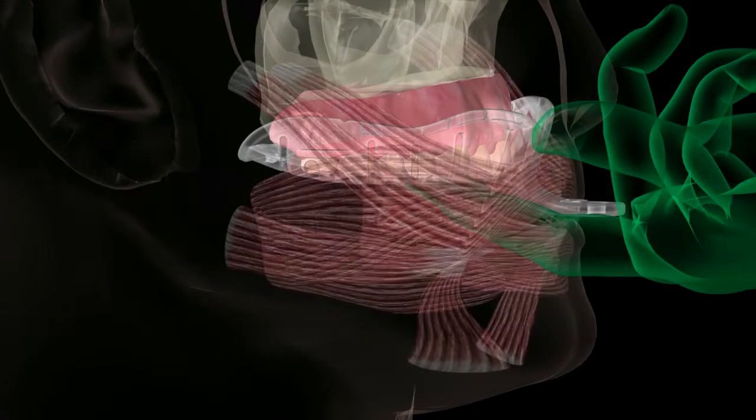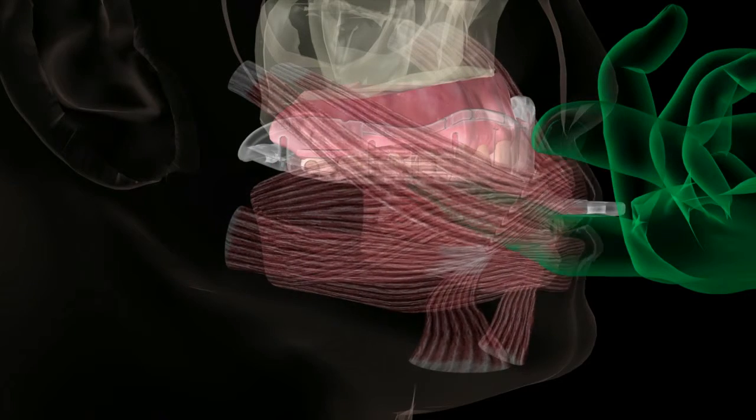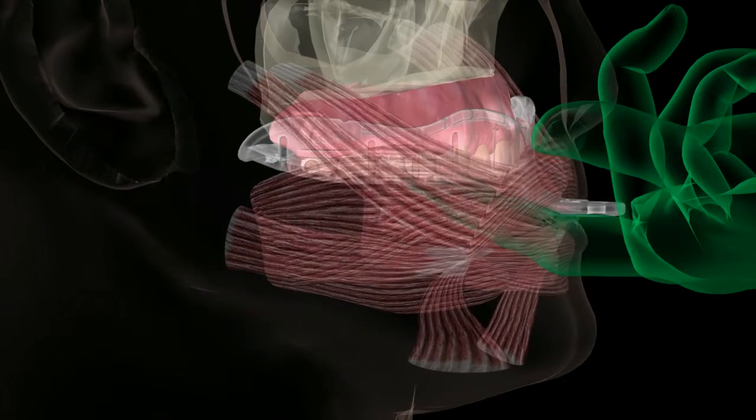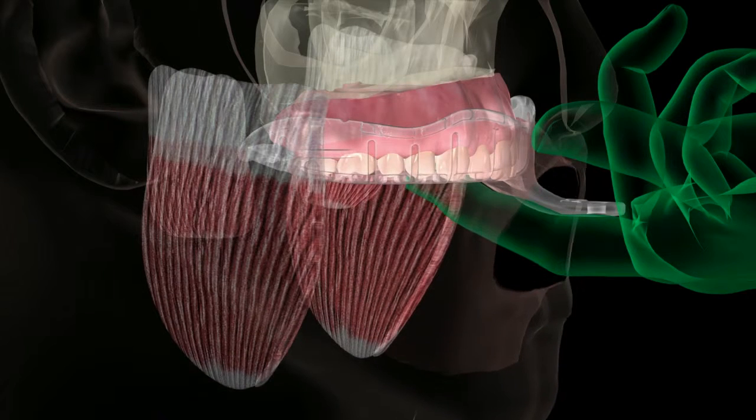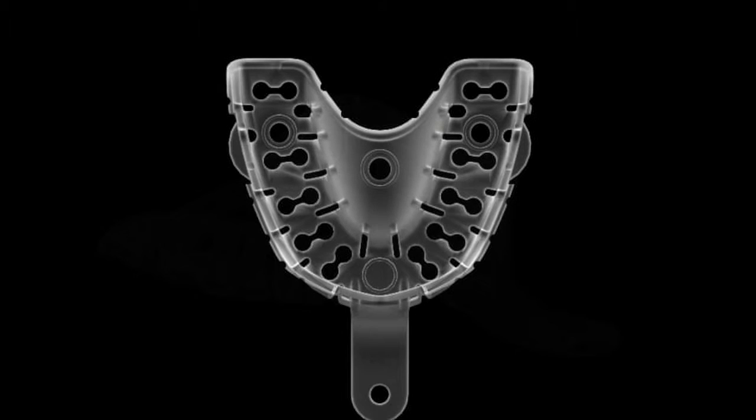The patient will then be instructed to suck outward, smile, and open to maximum opening. These motions should be accomplished within 10 seconds of placing the tray in the oral cavity. The resulting tray will conform to the shape of the maxillary arch.